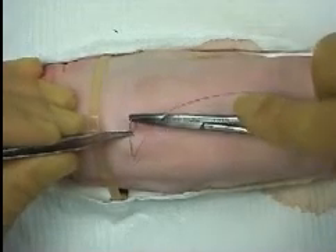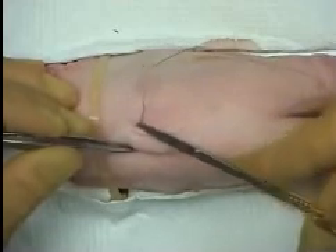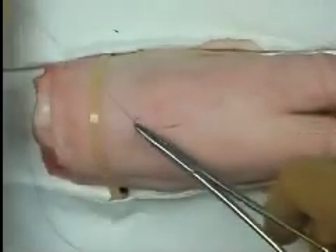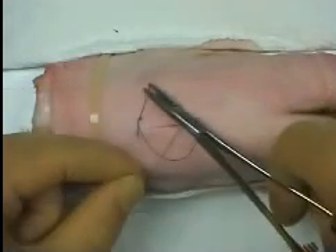The first bite is placed at one end of the incision, inserting the needle at 90 degrees to the tissue surface and roughly 5mm from the wound edge. After forming a knot using an instrument tie, the tail of suture is trimmed.